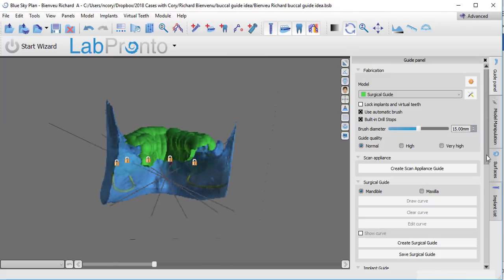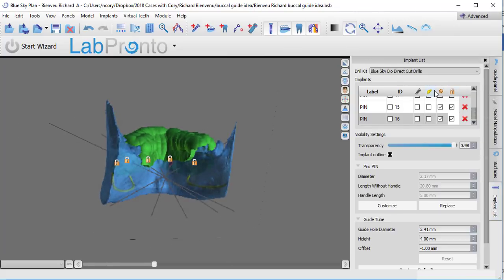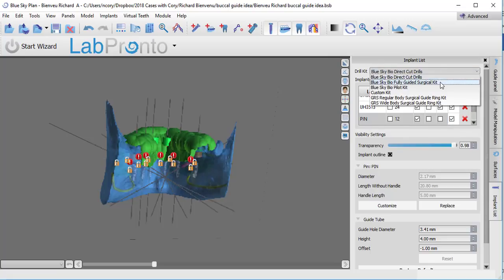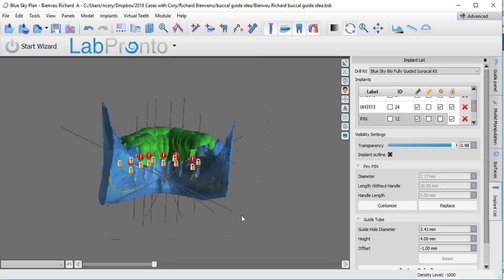So now what we need to do is turn on all of the implants and all of the guide tubes. All right. We also need to now pick what, and actually you don't need your pin tubes anymore. The pin tubes can be turned off. We're going to change to the Blue Sky Bio fully guided surgical kit, which is what's going to be used in this case.